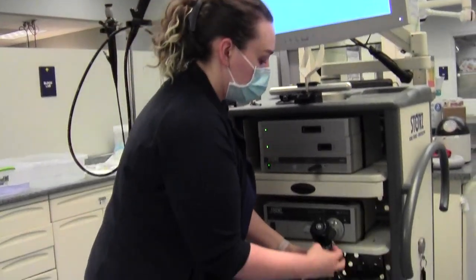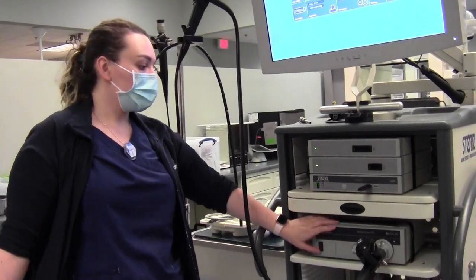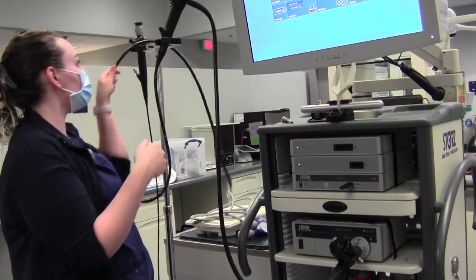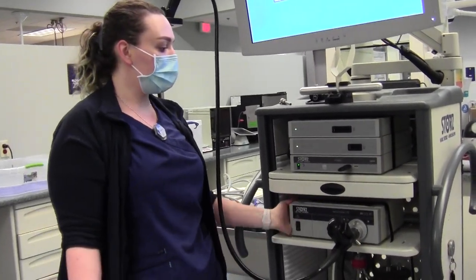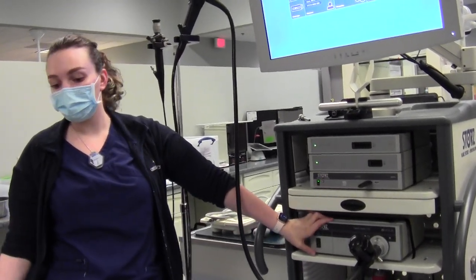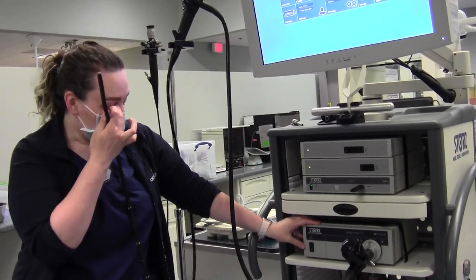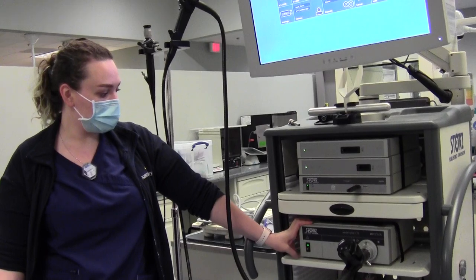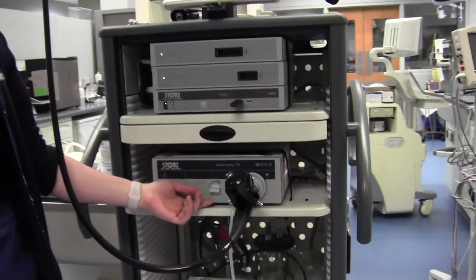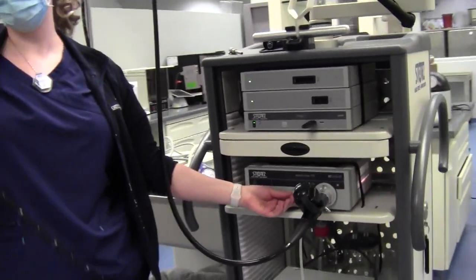We always like to cover our video output for cleaning. This is our light source box — this is how the light comes through to the scope so you can visualize what's happening. These machines get hot; there's a light bulb in here that can burn out. So I turn on the light at the last minute, right when I'm about to start. It's just a simple turn of a button, and there's a dial that controls the brightness of the light. At the end of every procedure, I like to turn it all the way off again to preserve the bulb.